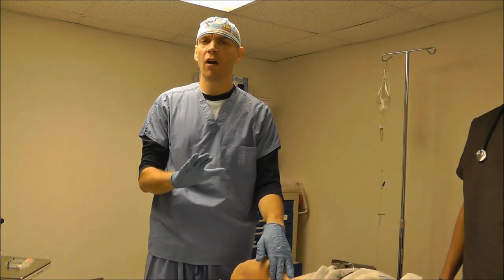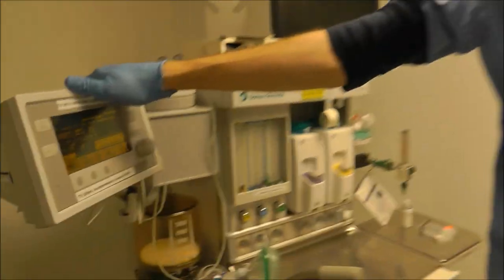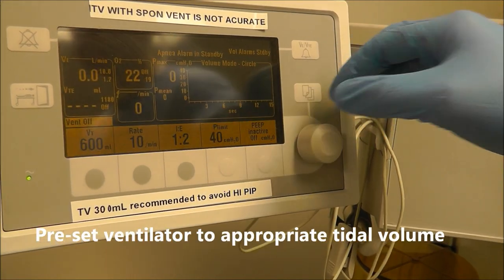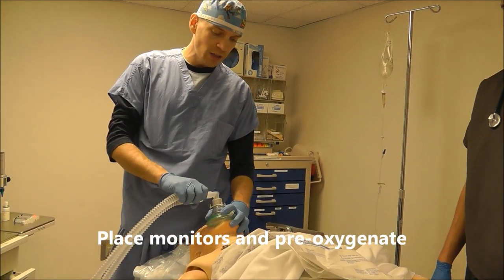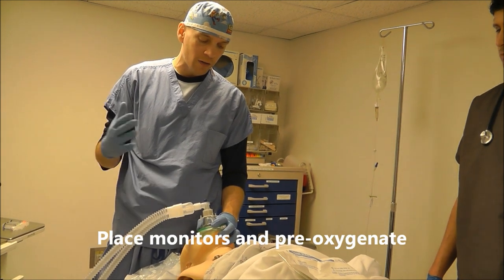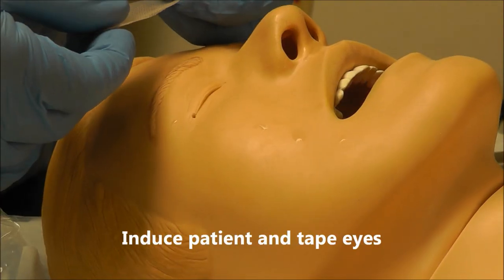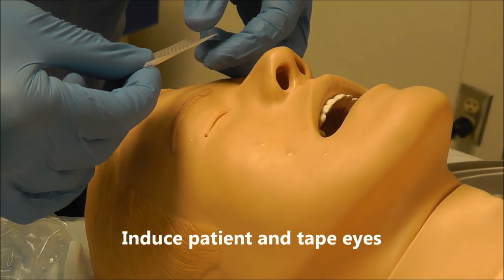Before you start, you want to make sure that you come over to the ventilator and set the tidal volume to the appropriate weight of the patient. Then we're going to pre-oxygenate the patient, and once we get the vital signs, we'll write those down, then it's time to induce the patient. The next step after induction is to tape the eyes.